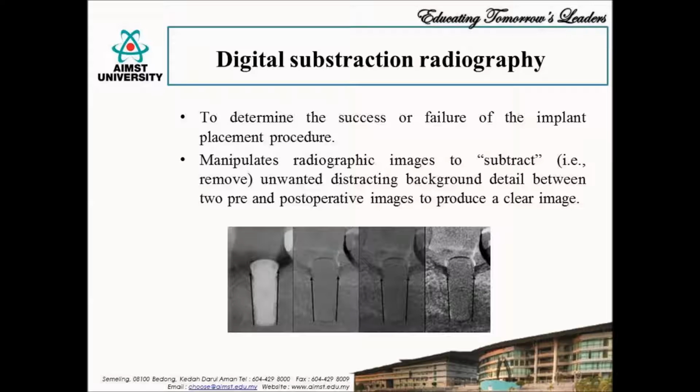Digital subtraction radiography, however, has been applied to post-operative evaluation of implants to address these problems associated with detecting changes on the radiograph. With the use of this, a computer digitizes and manipulates the radiographic images to subtract or remove the unwanted distracting background detail between the preoperative and postoperative images to produce a clear image. This is how digital subtraction radiography is useful for implant dentistry for postoperative evaluation.